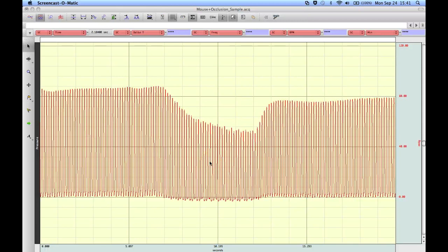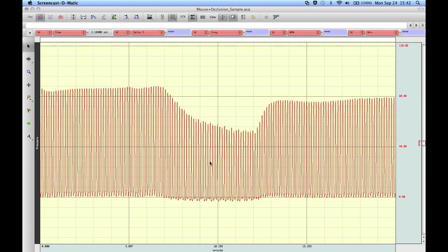The following screencast will provide a demonstration of ACKNOWLEDGE's automated left ventricular pressure analysis routine. This particular analysis routine is very similar to the blood pressure analysis, whereby ACKNOWLEDGE will take in any left ventricular pressure waveform. In the example I'm looking at here, this is from a mouse.